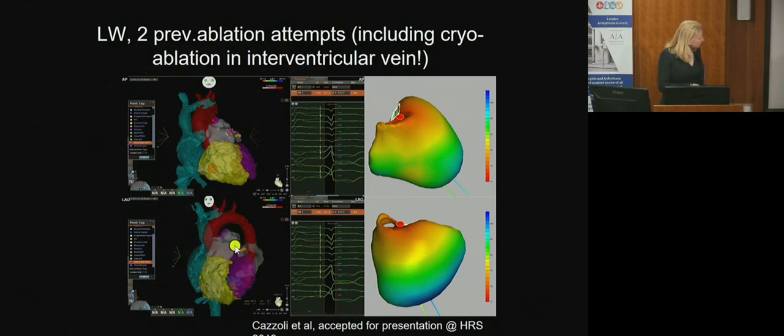We found the best pacing site, and actually the pink spots are where we ablated her successfully. That was the best pace map, and of course we ablated from the right ventricular outflow tract, and I think it was 2 burns and the whole thing went away. She has a follow-up now for over 4 months, and she's completely without any ectopy. So that was actually quite helpful to make that decision, how to plan the case. And despite the fact that she had so many extras, I think it was really helpful as well for the patient to have this reassurance.